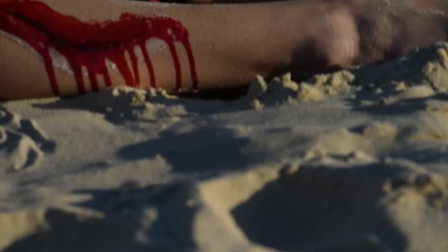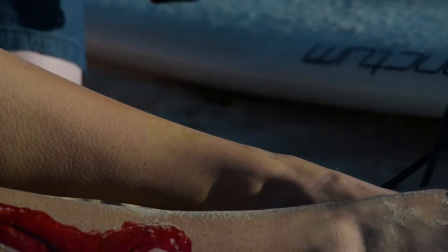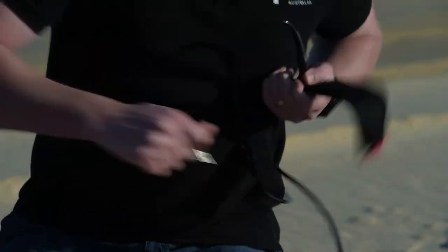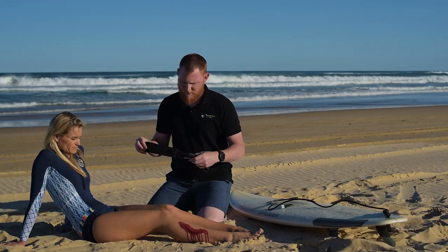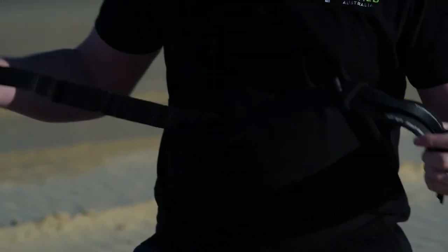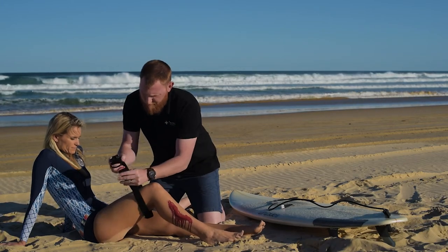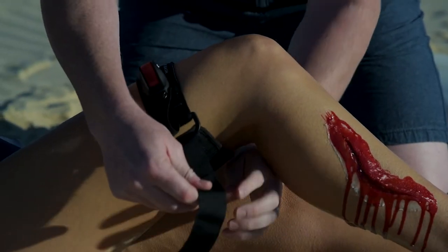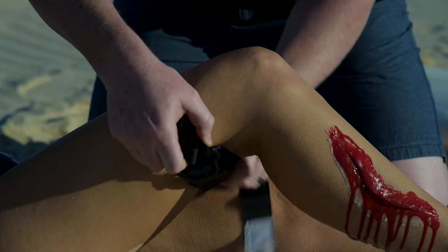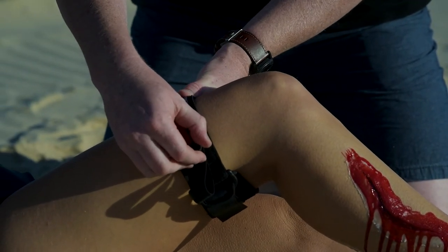We simply remove the ankle cuff off your leg or the patient's leg. In this version we'll release the quick release. We then pull the strap and place it around the casualty's leg. We do up the velcro and we simply ratchet until the bleeding stops.